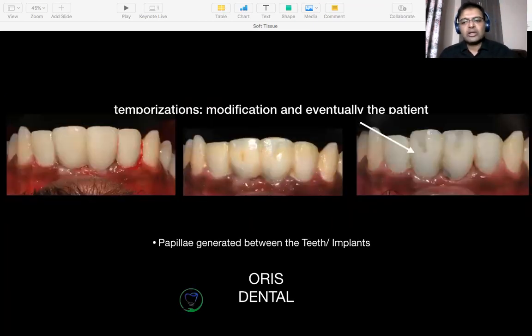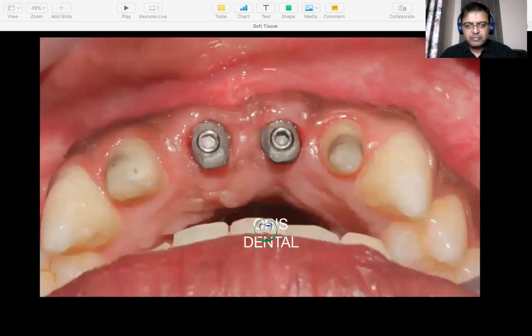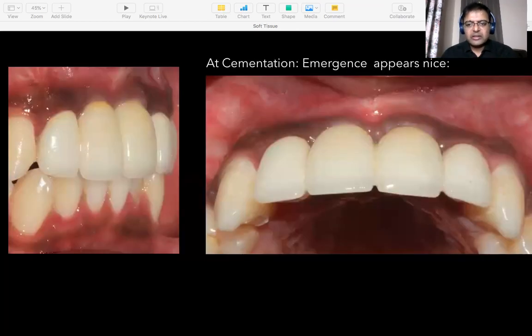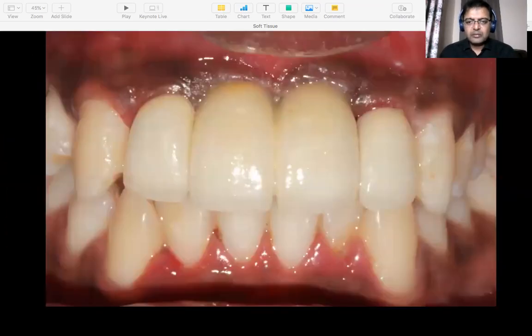Now we start contouring it with the temporaries. For the next 4 or 5 months, the temporaries keep on contouring. We start getting the shape, we start getting the bulk. And that's how we have the final abutments. You see a very, very healthy peri-implant mucosa there. And that's how we have metal-free restorations made in zirconia, fabricated and fitted there. So what you see now is you have ideal emergence. We have a nice inter-implant papillae and beautiful looking teeth for this patient.